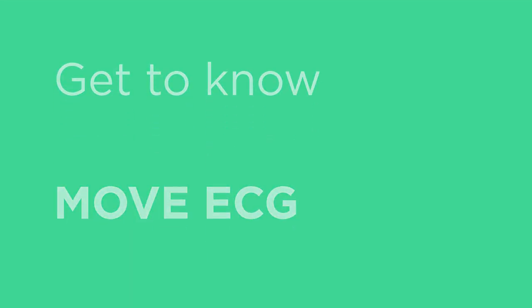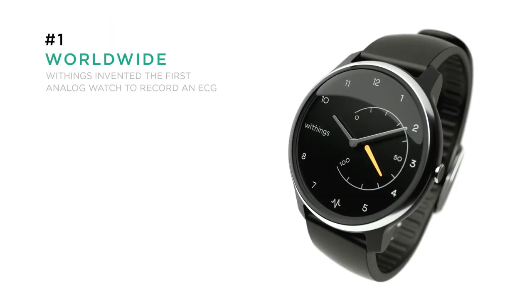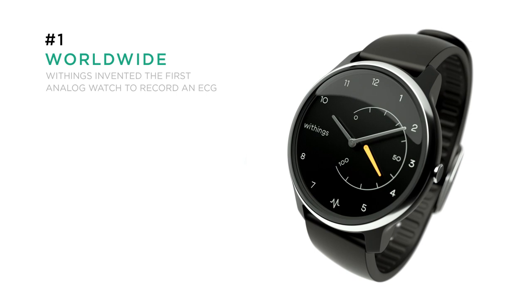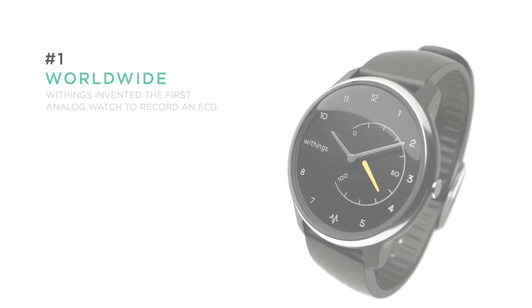Withings Move ECG is the world's first analog watch to record a medical grade electrocardiogram on demand to help detect atrial fibrillation, also known as AFib.